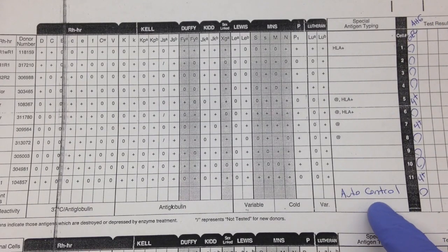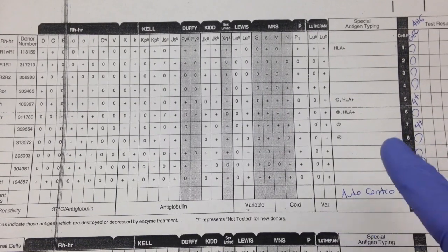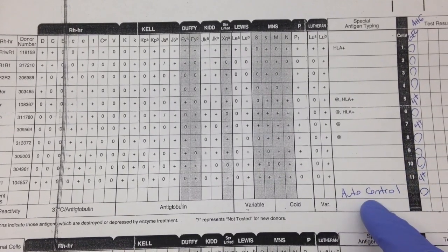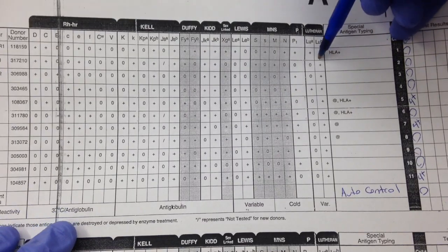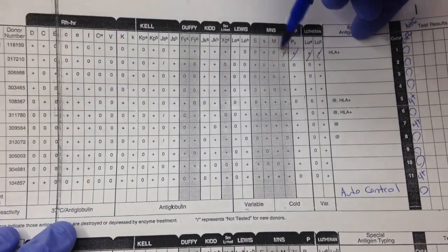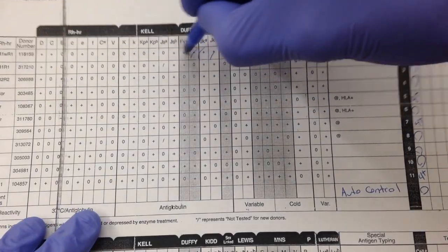I also want to point out that when you do a panel, typically you want to do an auto control. Some places might require you to do an auto control with your screens as well. Basically, an auto control is the patient's red blood cells mixed with their own plasma. This is just a method of ruling out a warm autoantibody that might be causing positive reactions.